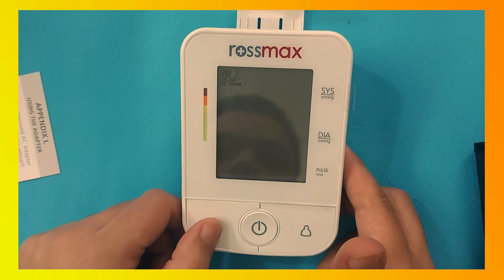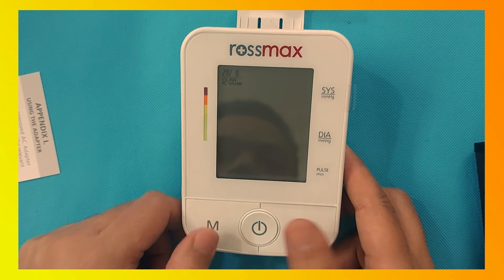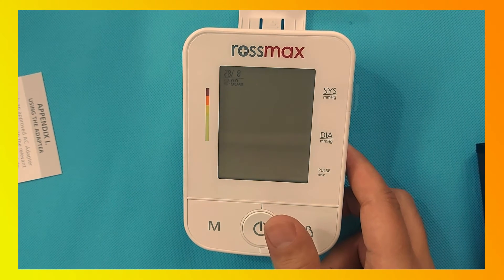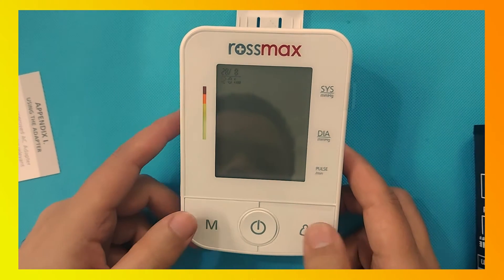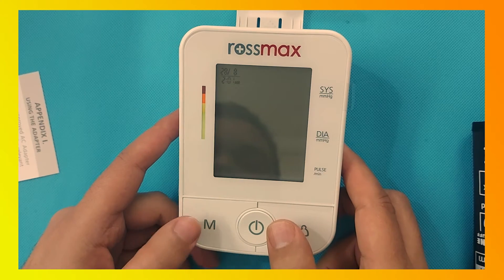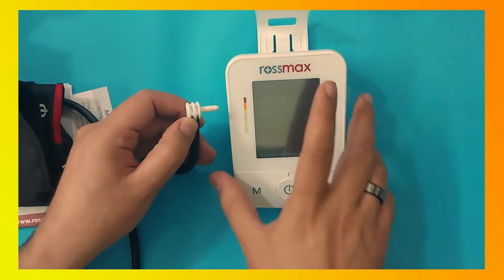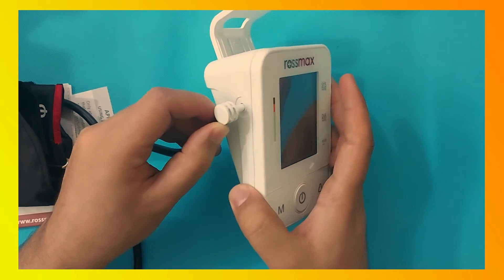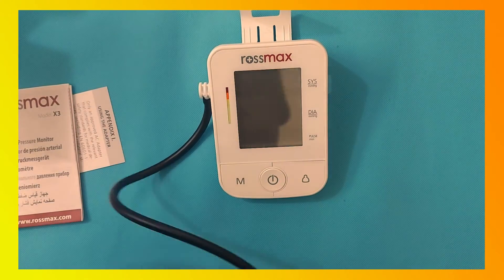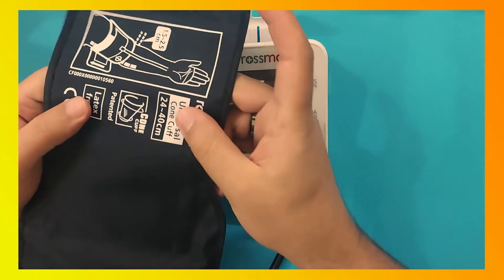Now select the date accordingly and press the power button. Then set the time — first set the hour and then the minutes. Now insert the tube into the device. The Rosemax X3 blood pressure monitor is now ready to use.